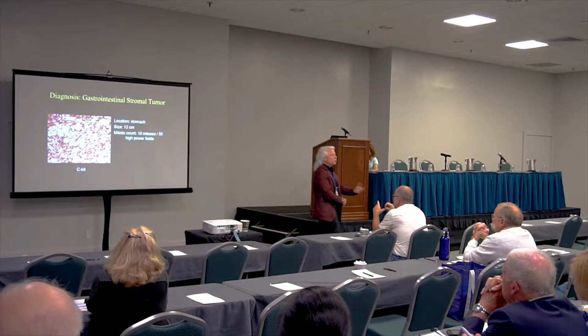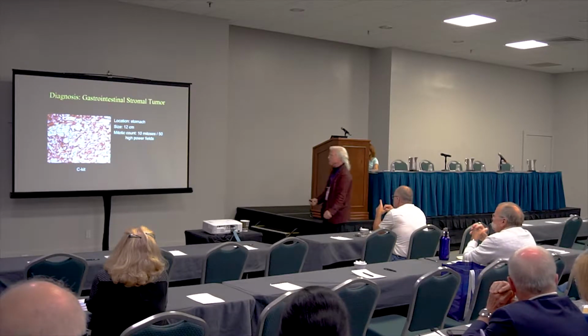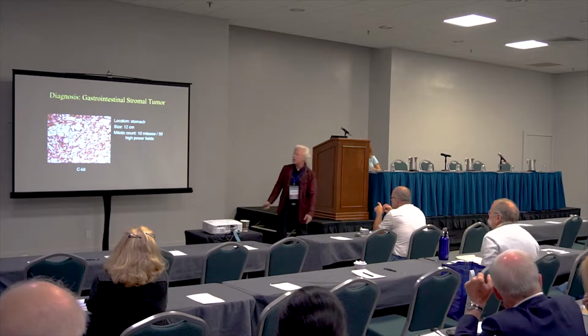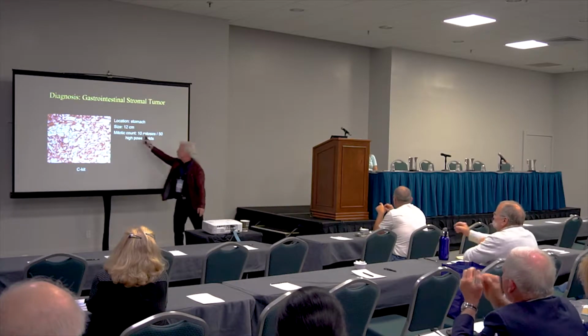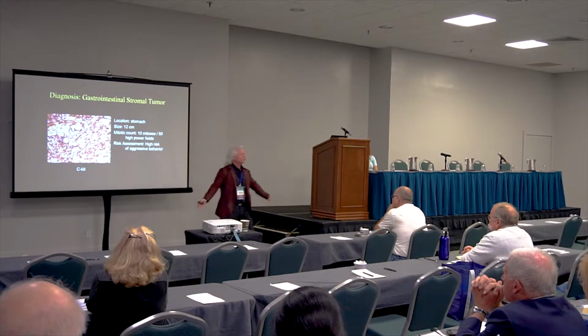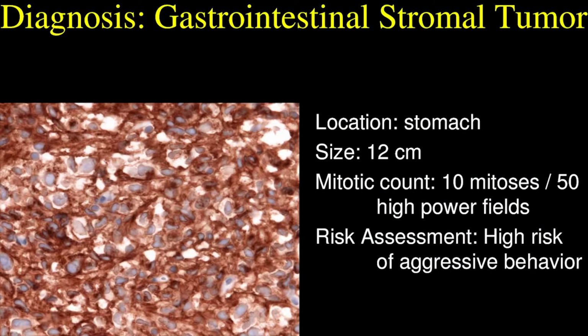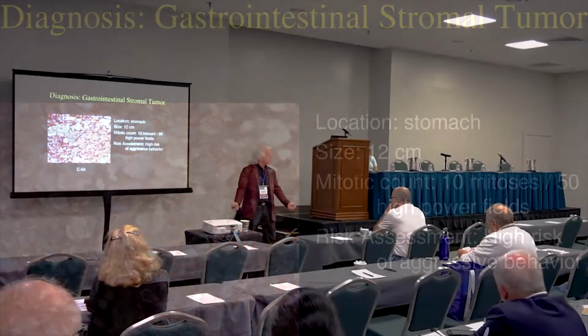I spend maybe 20 minutes looking at it, trying to do a very careful assessment of how often the tumor cells are proliferating, and that we translate into a mitotic count. And putting all those features together, I can provide a risk assessment of how that tumor is likely going to behave, so my clinical colleagues can devise the appropriate treatment team. But is that enough? No, and obviously that's not enough.